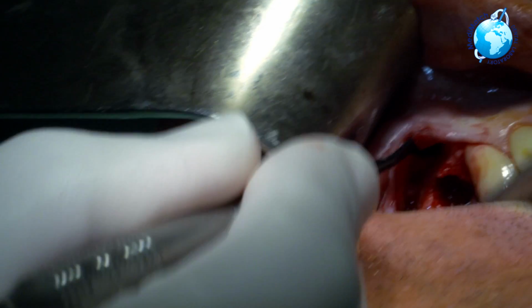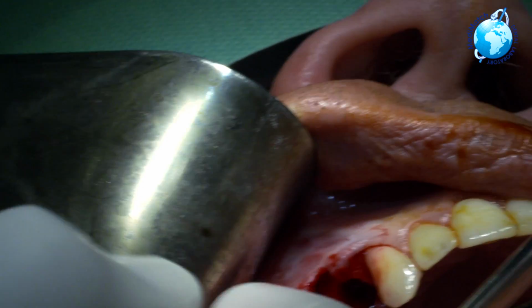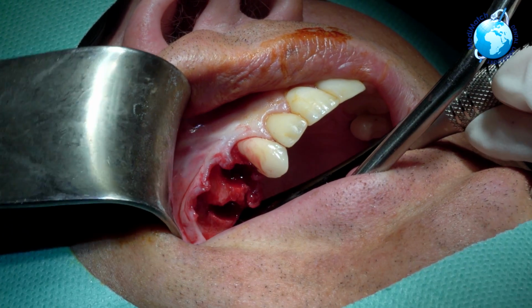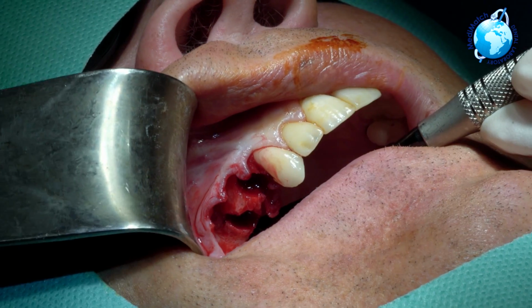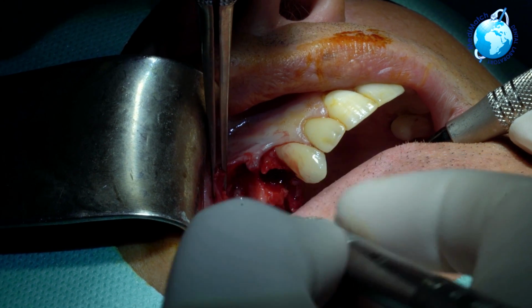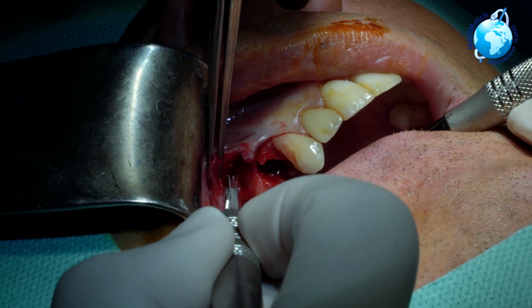Just like to do that. Alan, how you doing? Yeah, good. Looking awesome. And then we're just going to see there is a cyst. So what we're going to do with the cyst is I'm going to ask my assistant just to hold out the retractor there, and you've got a separation of granulation tissue from the gum tissue. So I'm just going to gently dissect that away from the gingiva.